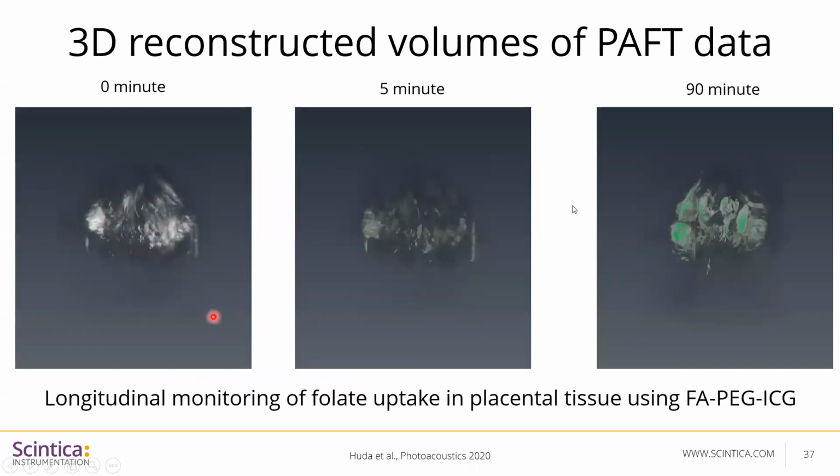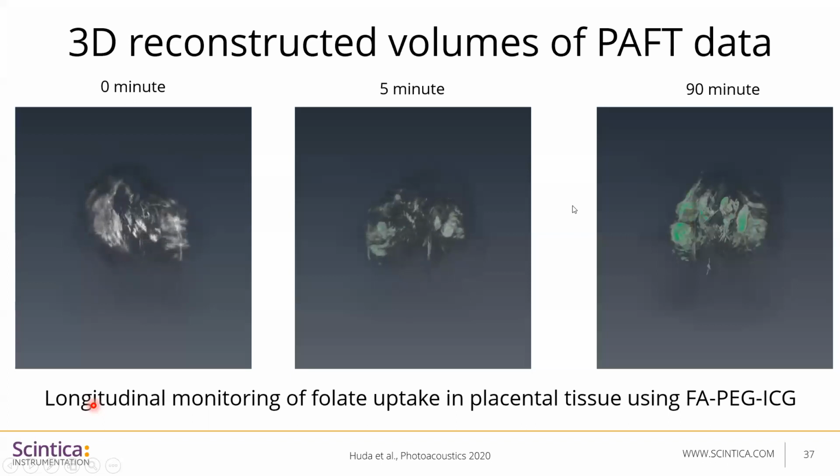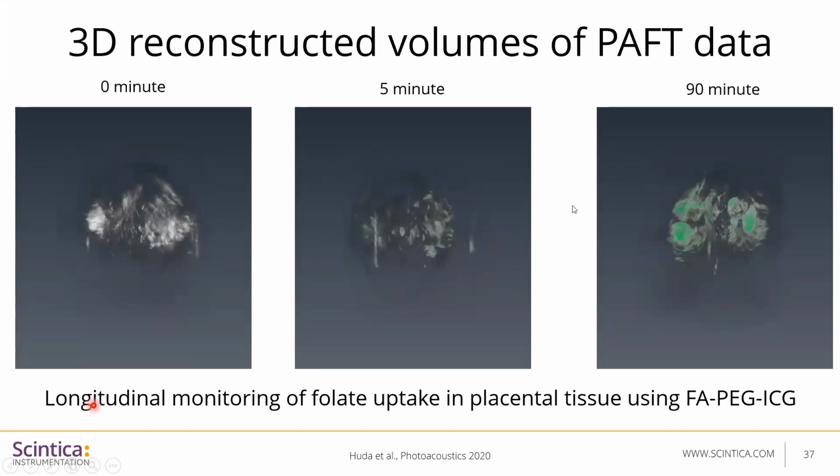So just to give you an overview of how these images look. This is the image at 0 minutes when the contrast was not injected, and as you can see there was no signal. At 5 minutes when the contrast was injected, there was an increase in the signal, but it wasn't significantly high enough.